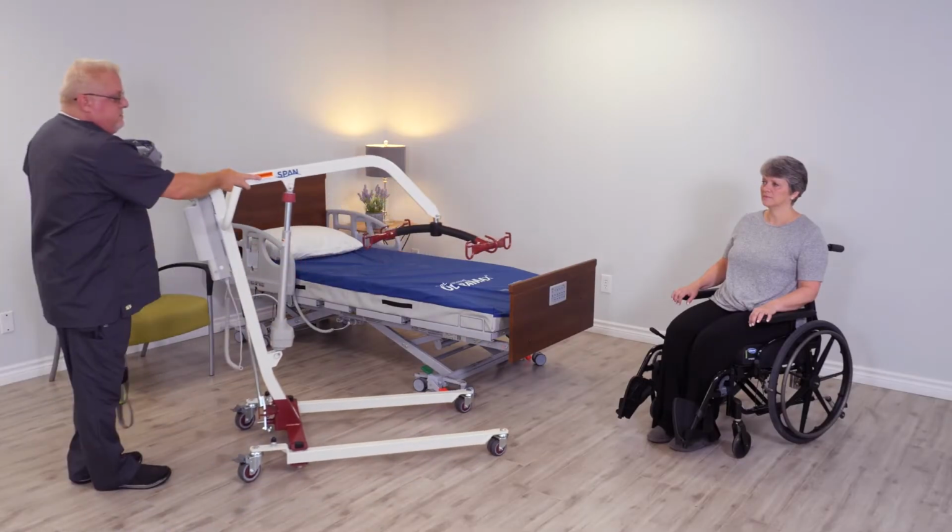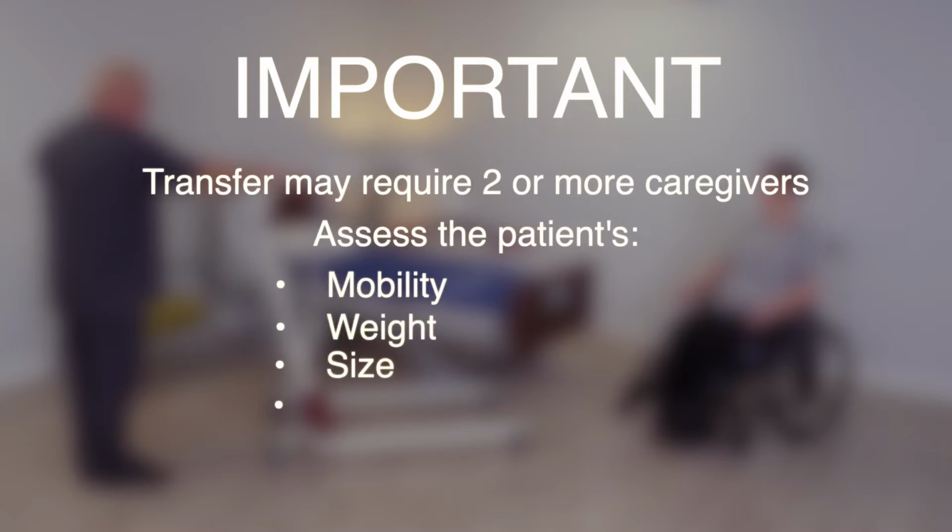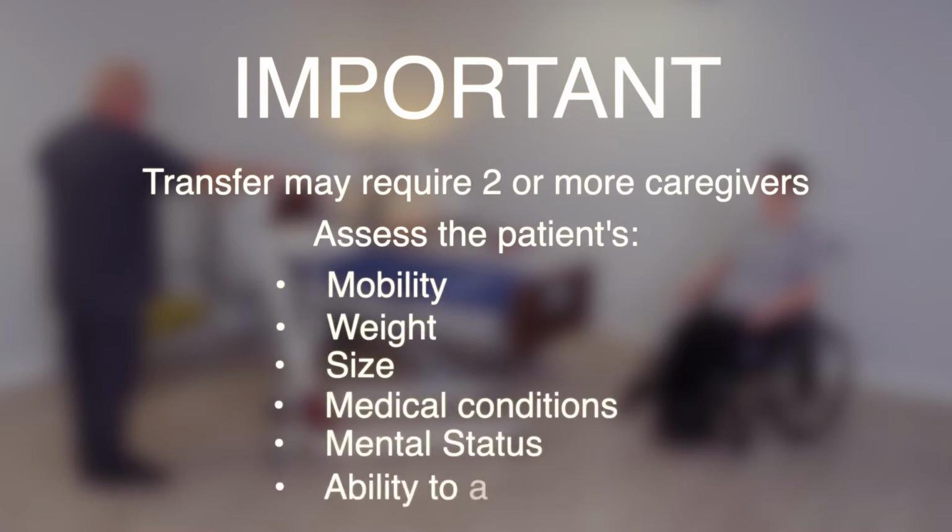Note that 2 or more caregivers may be required for a transfer based on full assessment of the patient's level of mobility, weight and size, medical and mental status, and the patient's ability to assist in the transfer.